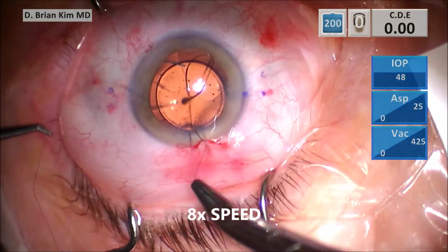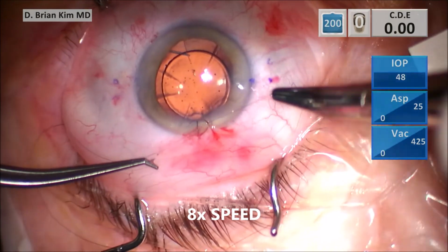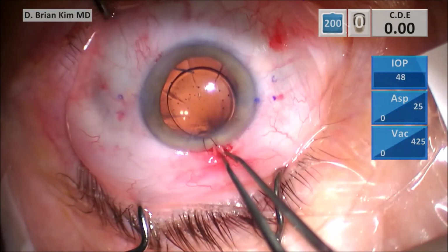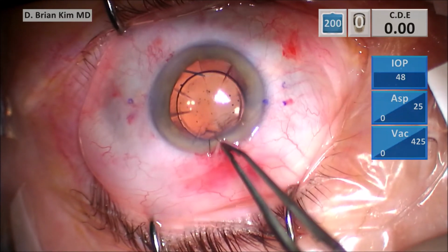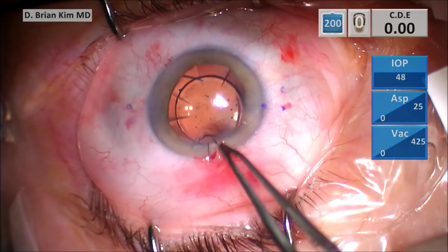Go ahead and place another suture through the main incision. I noticed there's a little bit of leaking of that incision. I didn't show that because I kept hydrating the wound and it kept leaking. I'm gonna go ahead and place another suture through there. I don't know if it's related to the RK incision causing some instability there, but I went ahead and placed another suture. Now I have a nice closed eye. The wounds are all sealed.